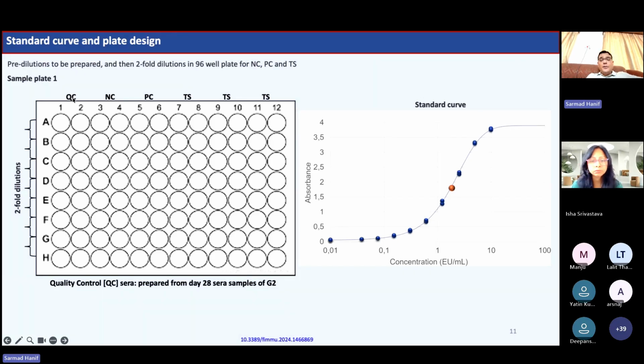See, Dr. Isha, you were asking that if there is a new emerging disease, then you will have a problem in making the quality control. For some infectious diseases like Neisseria meningitis or Haemophilus influenza type B, the quality control, which is the positive control for all the plates, will be the standard curve. Against this standard curve, you will be identifying all the other curves for your samples, and then you will get the reading, whether it is low, high, or whatever it is.